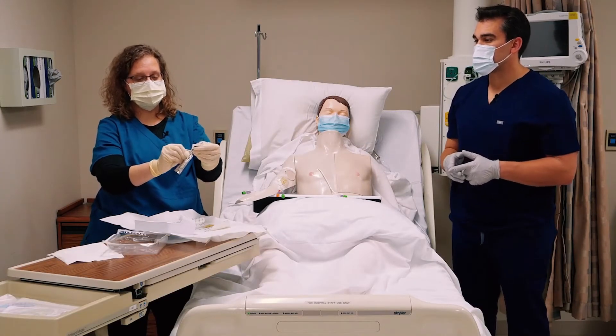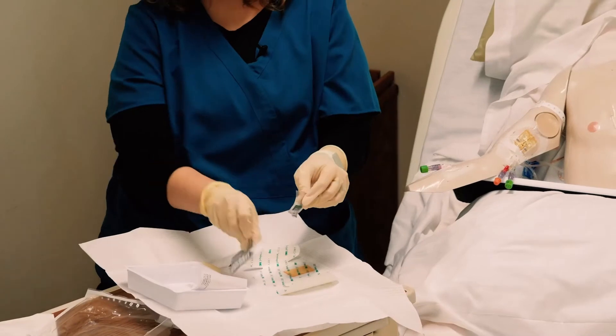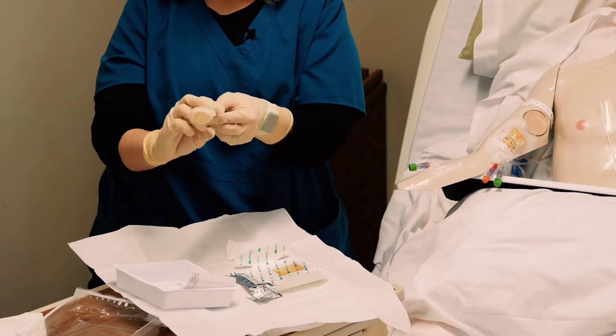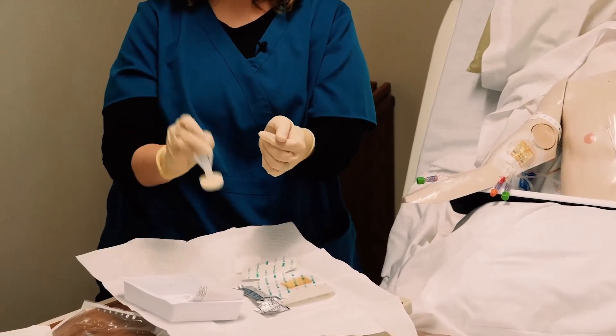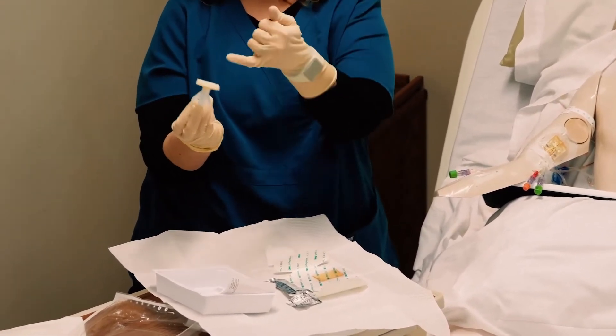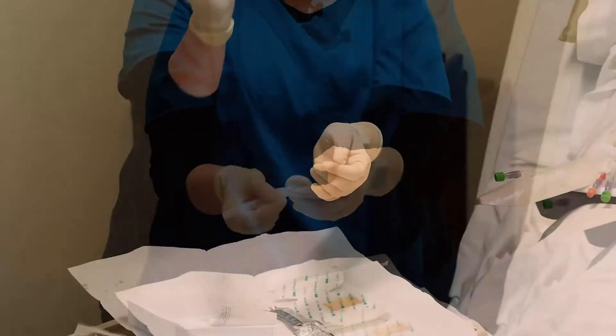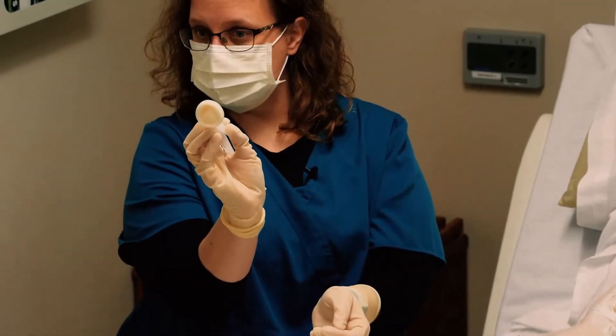I'm going to take my CHG and pop it, then shake it down until the center looks wet — that little triangle there should start to look wet and damp. Now this is not like the iodine swabs and alcohol swabs we used to use. For those, you would always go center-out in concentric circles. With CHG, you actually go back and forth.